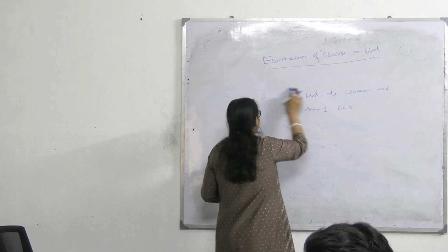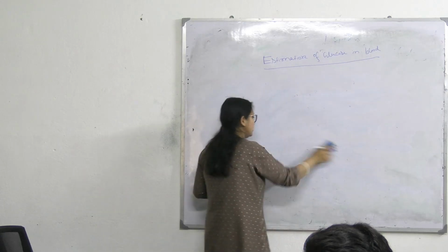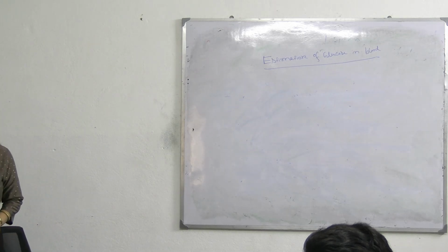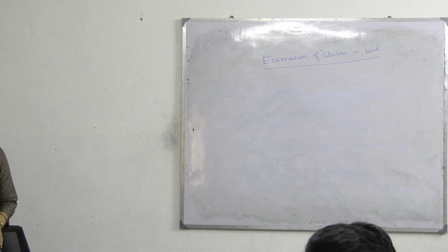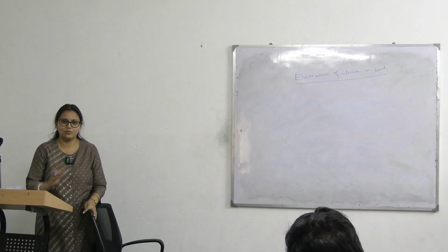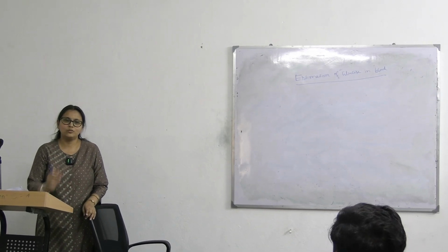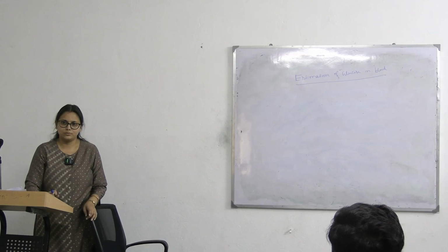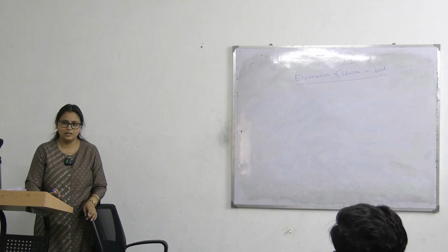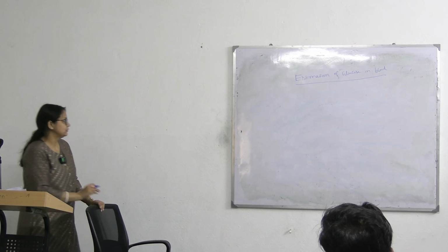আচ্ছা, কলোরিমেট্রিতে রেজাল্ট আমরা কি হিসাবে পাই? In which form will we get the result? ডাইরেক্টলি কনসেন্ট্রেশন দিয়ে দেয় না কি করে? If we put the sample, color sample, then we will get the direct result, the direct concentration of glucose, or we have to calculate it? Calculate. So what it will give? In which form will the result come? বল, কনসেন্ট্রেশন তো দেবে না, ডাইরেক্ট ক্যালকুলেট করতে হবে। তাহলে হোয়াট উই উইল গেট? Absorbance.